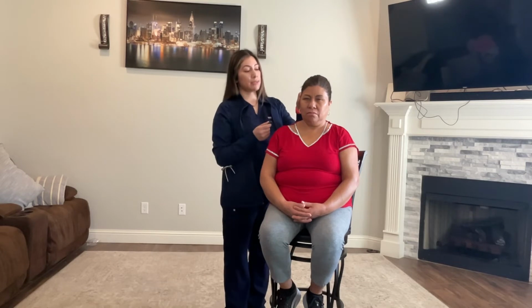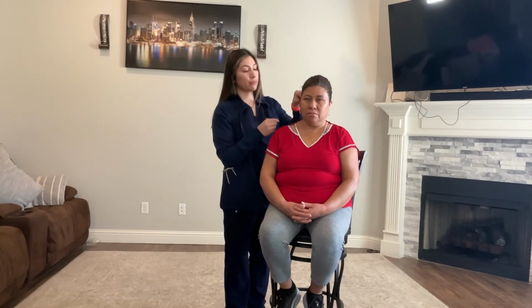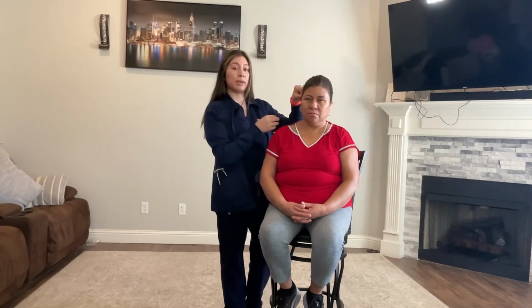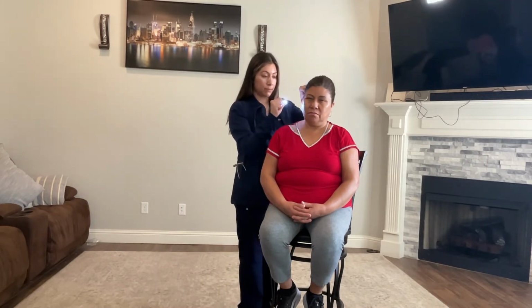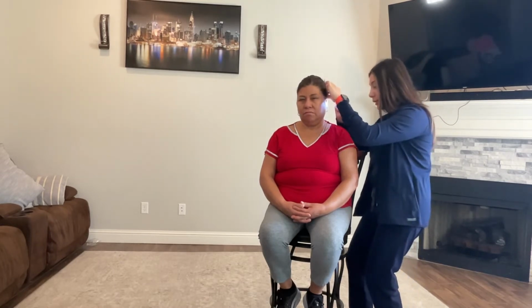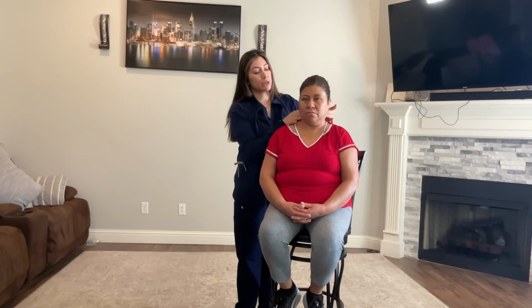I will now be assessing your ears using my otoscope. This otoscope is going to help me assess the ear canal, the tympanic membrane, and the middle of the ear as well. Okay, you're going to feel me touch your ear. Pinna is up, and then I'm going to pull back. Tympanic membrane is clear, gray, and shiny. I'm gonna feel her ears now. Any tenderness? No. Okay, great.